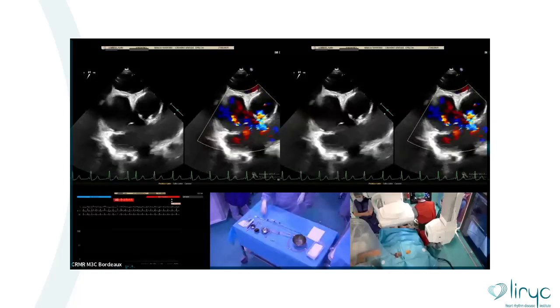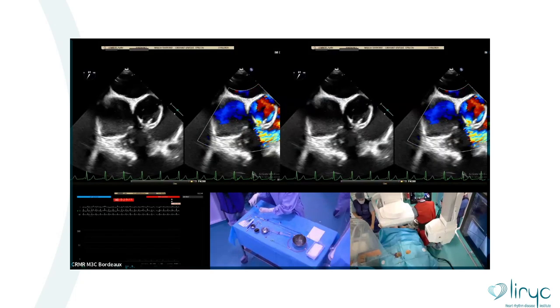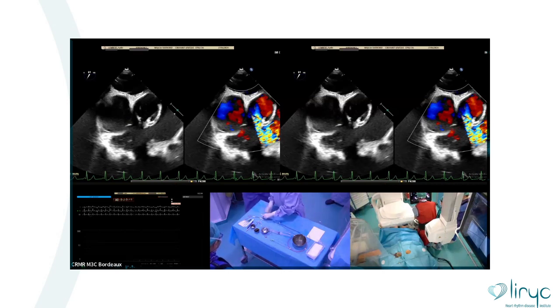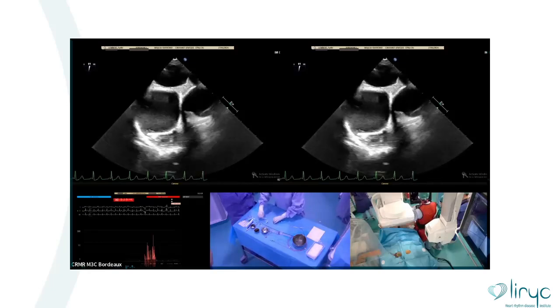And the hole itself. So one of the key points when you assess a VSD is, first of all, the localization. So it's a perimembranous VSD. And the size. So you will use different frames to assess it. And you will assess the different diameters. So here it's a left diameter. And here it's not the ideal one. I will show you this is a right diameter. So with my colleague, we said that it's between 6 and 8 millimeters, 8 millimeters on the right side. So the 60 or 45 degree is the good one, and you will continue.